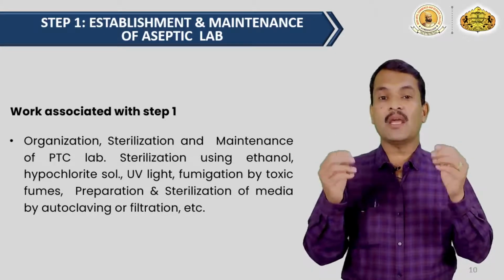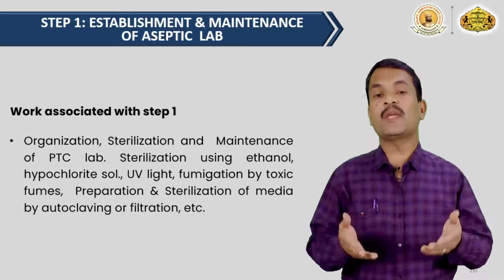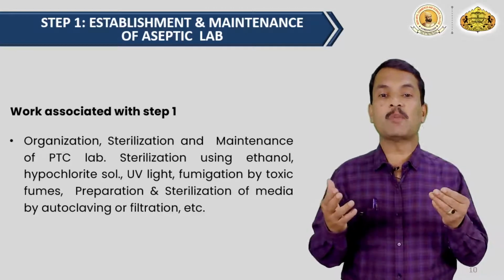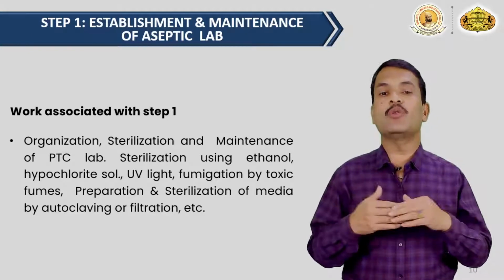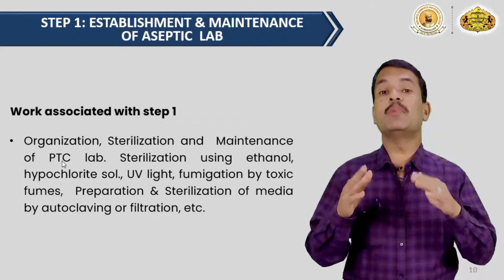If you carry any kind of microorganism, or if your cultures get contaminated with different types of microorganisms, your culture will be destroyed. So you need to take precaution. All these things will be very important.